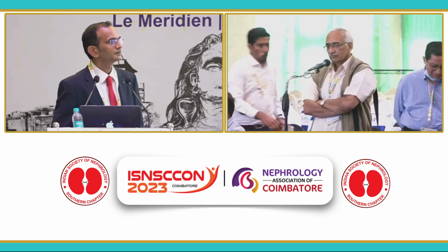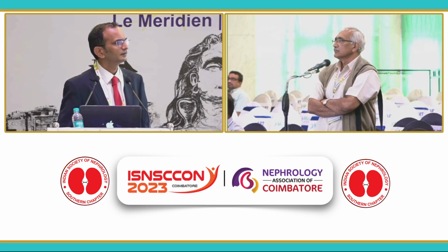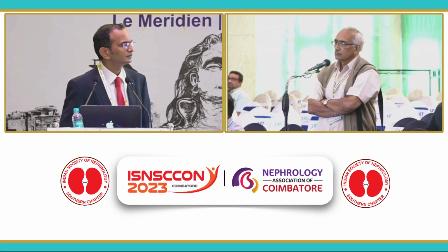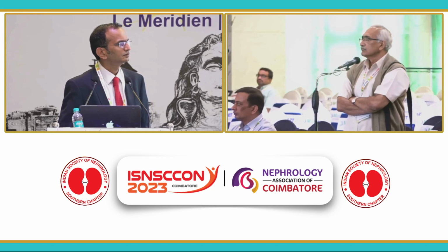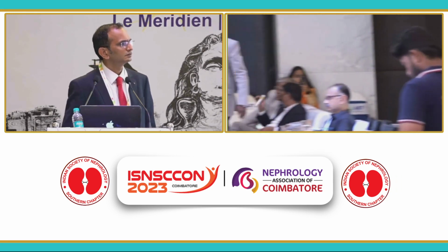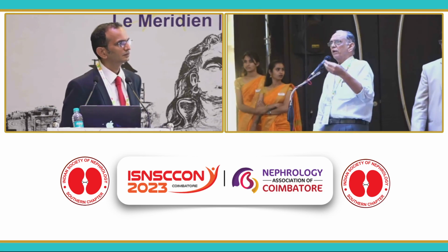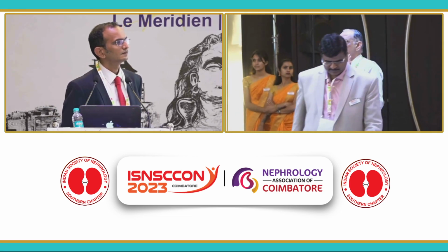Yeah, interesting concept. The fouling occurs in the RO membranes as well. And when fouling occurs, in the early stages, what we do is remove the RO membrane and give a mechanical shock, not ultrasound shock, mechanical shock, and the fouling considerably disappears.